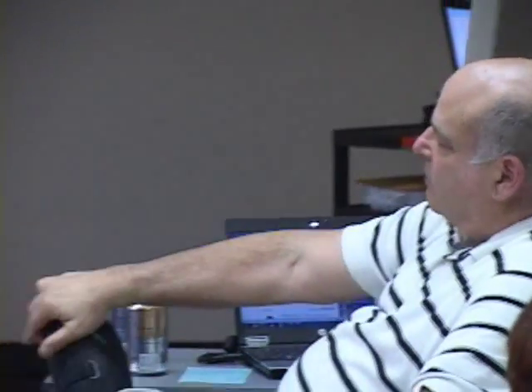How about this? The other thing is the clarity, I guess we're talking about contrast, between the tissue and the background when it starts to become fuzzy. Usually if you're getting a fuzzy image, the number one cause is your OID, how far the object is from the image intensifier. Now you're doing a swallow study, the patient's in a lateral position and you've got the distance of their shoulder to their neck, right? Whereas when they're in the AP position, their back is right up against the image intensifier. That's going to be a much sharper image than this.